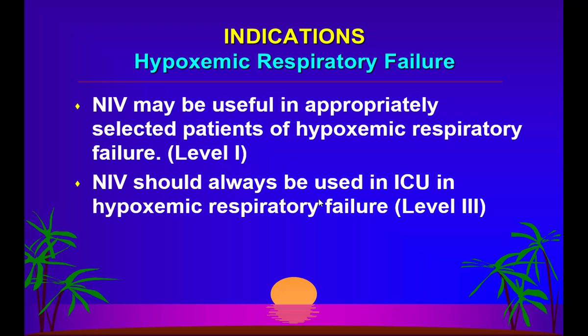All right, and whenever using it in hypoxemic respiratory failure, it should be used only in an ICU setting, because these patients can worsen and may require invasive ventilation. Remember one thing: non-invasive ventilation does not wipe out your invasive ventilation. You have to have invasive ventilation as backup, even in case of COPD, even in case of ARDS, particularly in patients of ARDS. It has to be used only in ICU setting, not in the ward. That is very, very important. Because in hypercapnic respiratory failure or COPD, you can use it in the ward also, for patients who are stable.